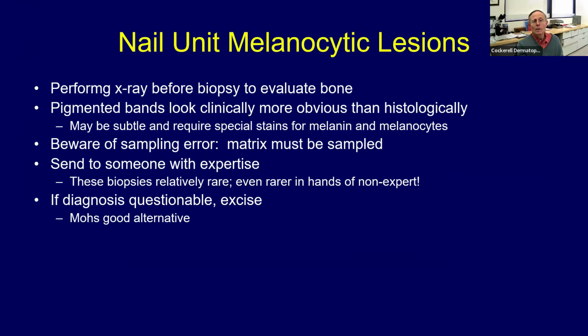So last thing is to talk a little bit about nail melanocytic lesions. These are not for the faint of heart. If you don't have experience with this, you shouldn't get into this field.